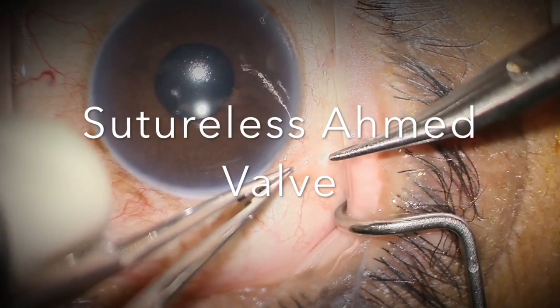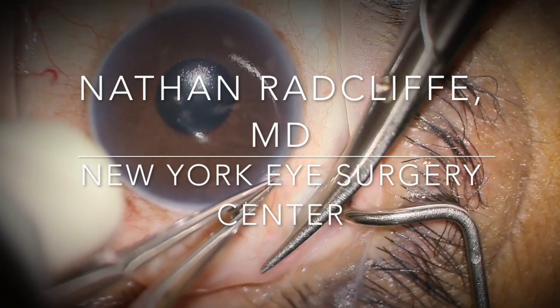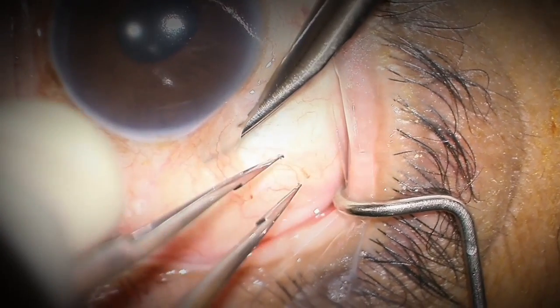This is Nathan Radcliffe and I'm sharing with you my sutureless Ahmed valve technique. This is performed at the New York Eye Surgery Center in the Bronx.